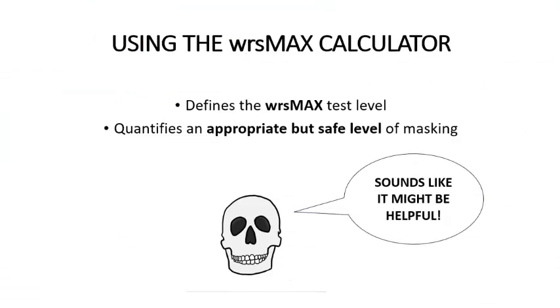We hope you'll find the wrsMAX calculator to be helpful for WRS testing, particularly when trying to mask a non-test ear that has some kind of conductive hearing loss present in that ear. You'll find the wrsMAX calculator spreadsheets for insert earphones and supraoral headphones at maskinghandbook.com.